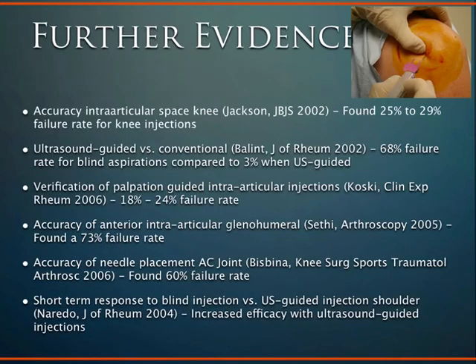There's a lot of literature out there, and it's just growing, about how inaccurate we are with our blind injections, and some of these numbers are staggering. Coming down to the bottom, a 60% failure rate, 73% failure rate.